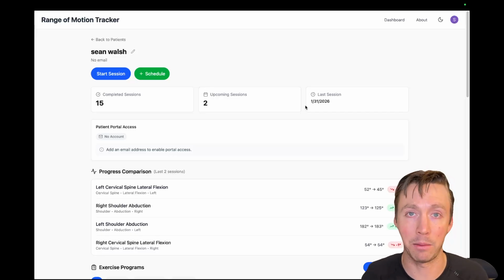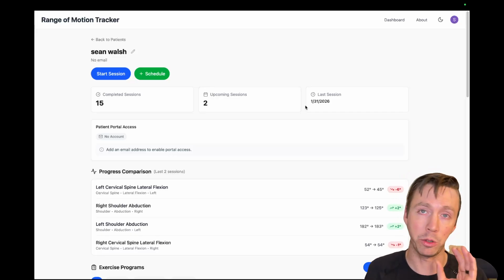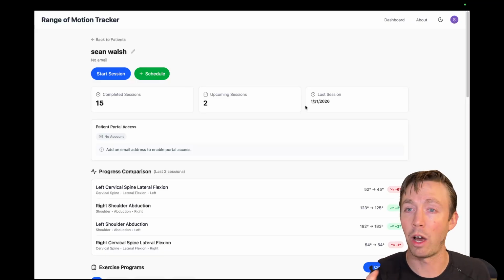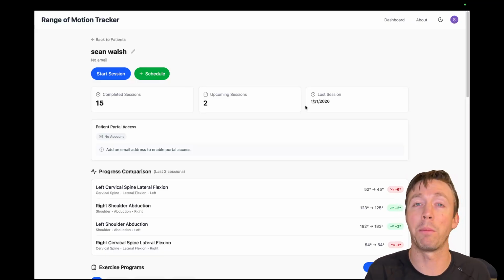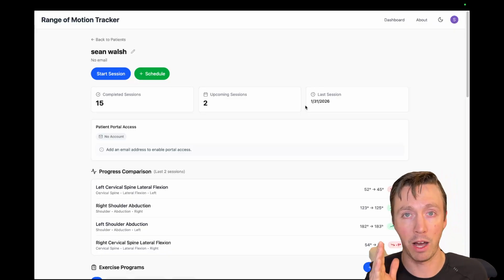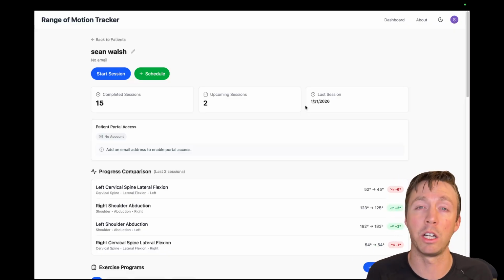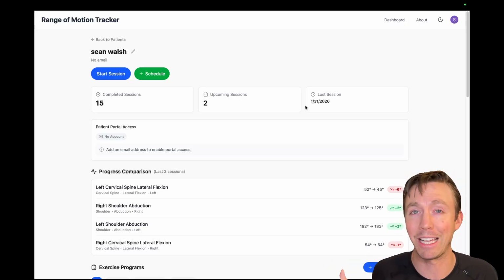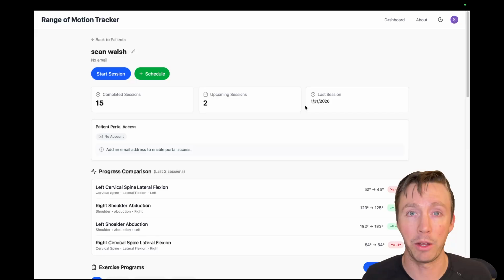We're very excited about its utility. Again, we have the utility from a clinician standpoint, but we also have data capture for, say, manual laborers that we want to make sure that we prevent their injuries. This is something that is not meant to replace a clinician, but more a tool to utilize. So we already use a goniometer in the clinic to help measure the range of motion. This is going to be something that shortcuts that. Very excited about the utility.